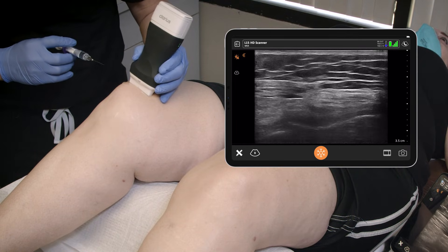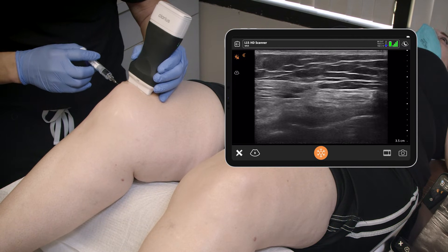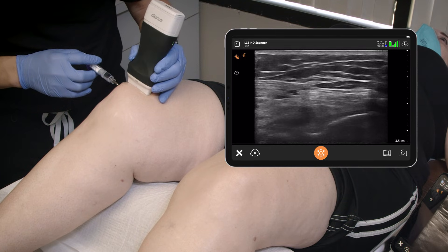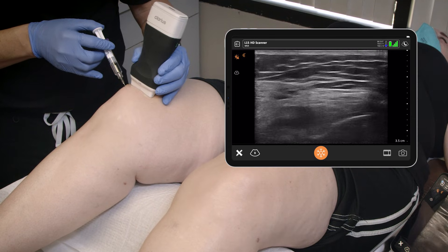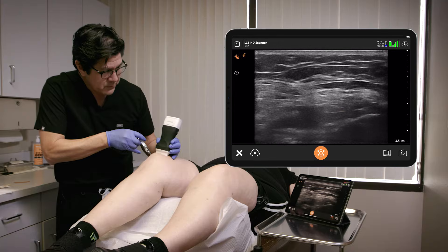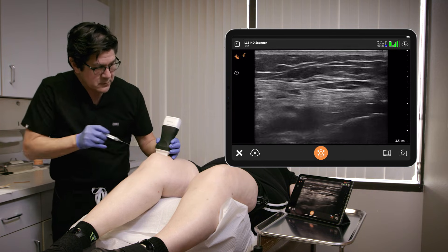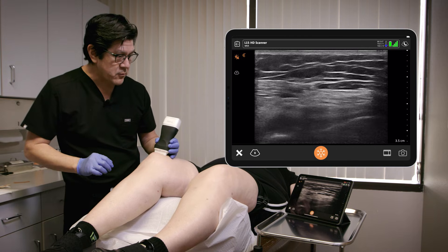And there we go, right there. And shot. A little high — reorienting to be a little bit lower. Got it down right there, and we're right into the space perfectly. Now I'm injecting. You can see it flowing all the way on that lateral aspect, so we know we're in the right spot. We knew we were in the joint, and we saw that flow occur laterally so we knew we were in the right spot.